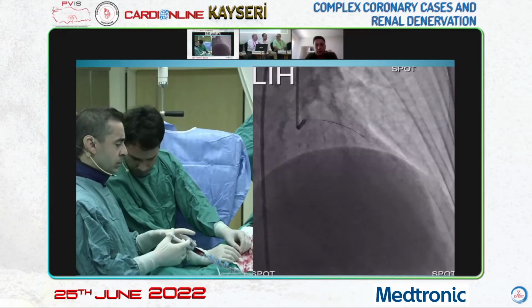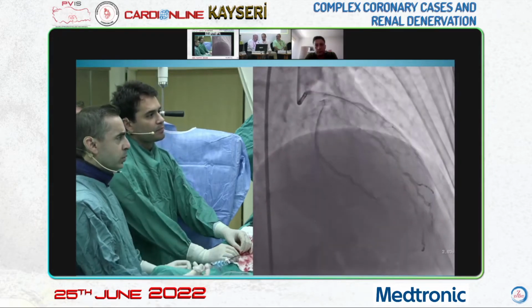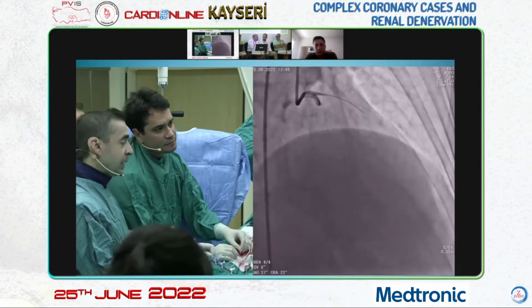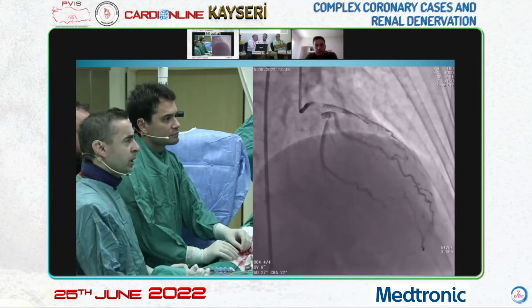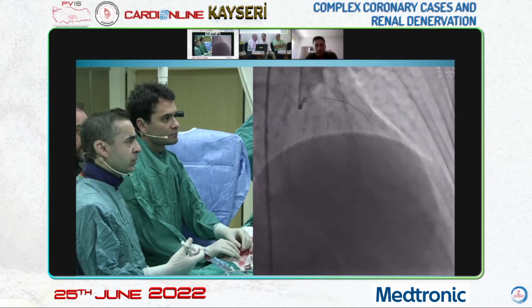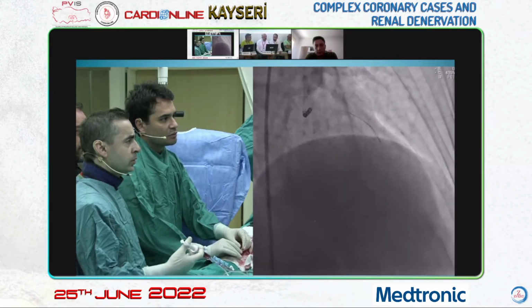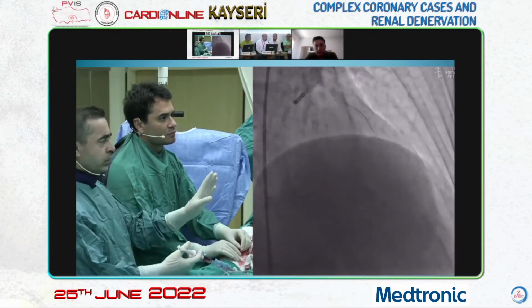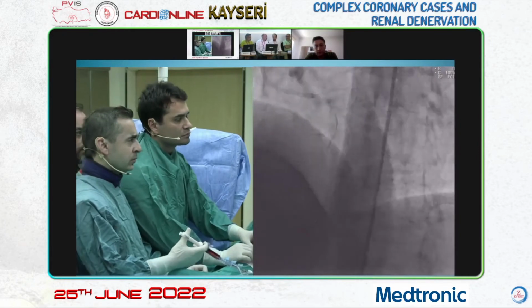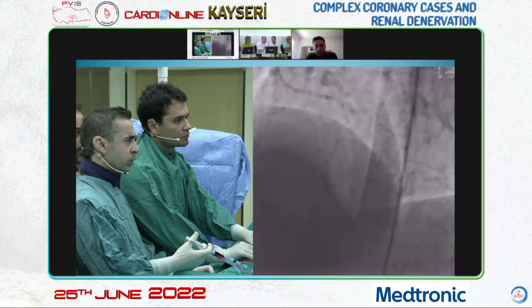Would a stiffer and thinner wire than the Pilot be required? What do you think? Maybe, but here a dual angiography may be done to see how the distal is filled. In CTO, actually, the first thing to do is this. At the moment, there is no dual injection. There is no retrograde fill. Therefore, we are dependent on IVUS, right? Yes, the Pilot wire is suitable for me. Nihat also started with that.